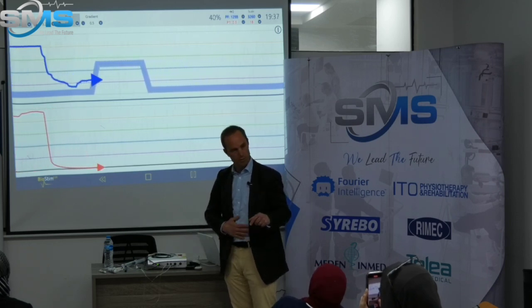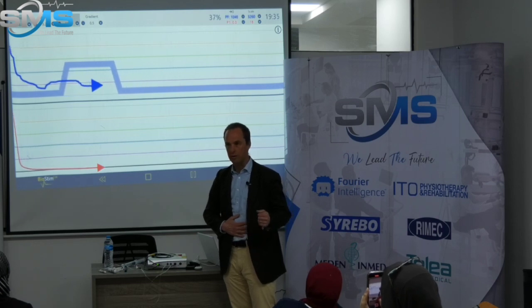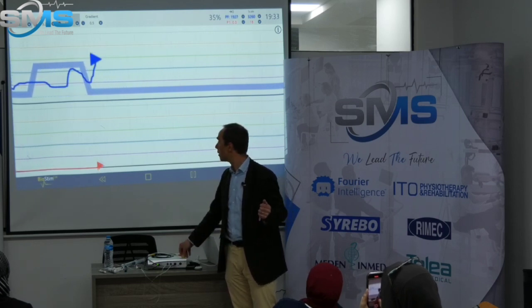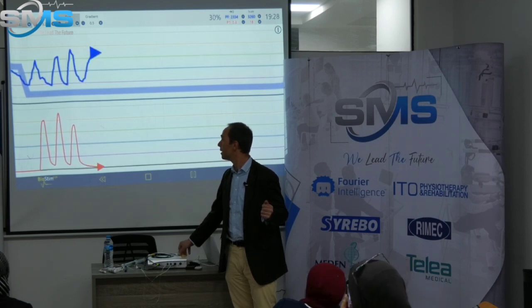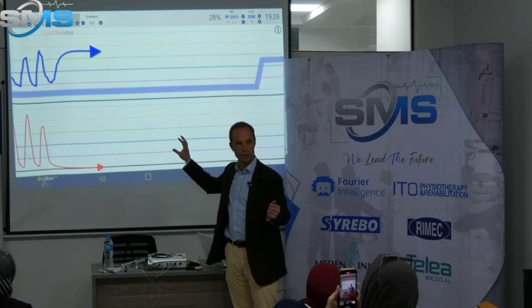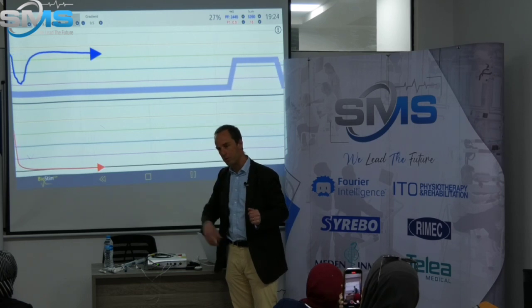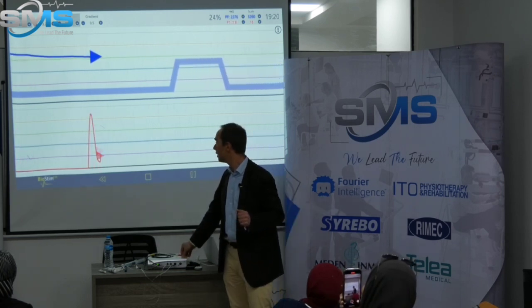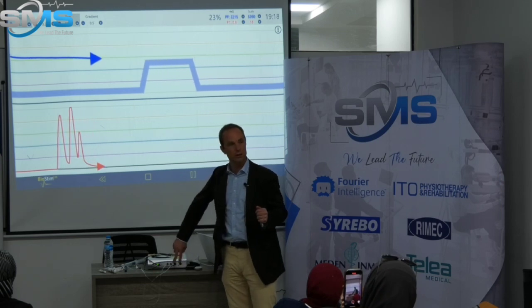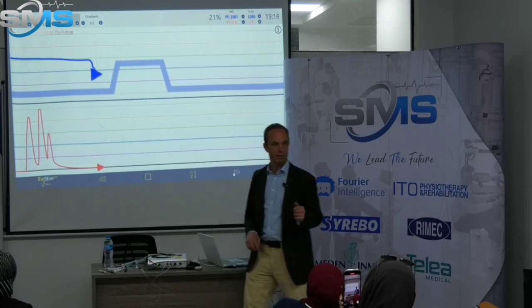You can tell her to put her hand on and feel if she's contracting, and make sure that she's not doing this kind of thing, and in some time she will contract only her pelvic floor without abdominals, or without any parasite contraction, and that's what you want. So that's the interest of having 2 different channels on this device.